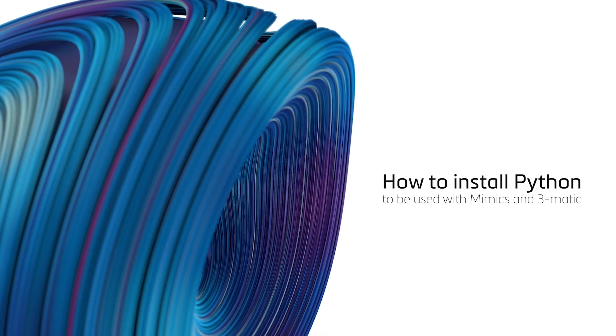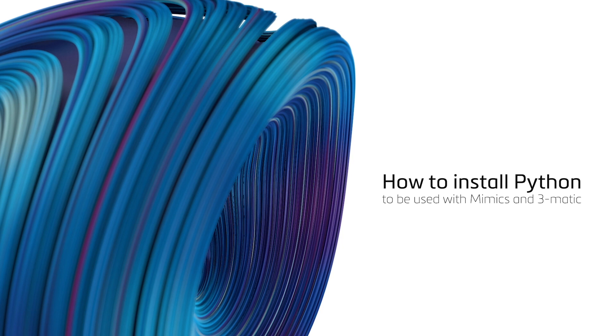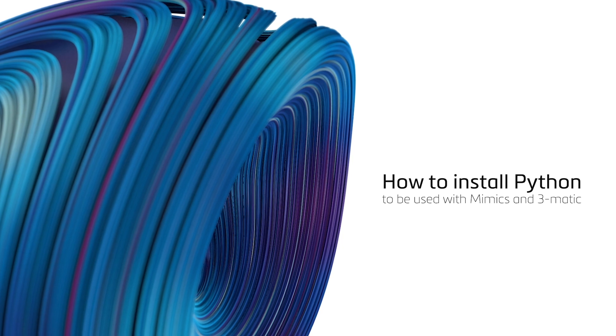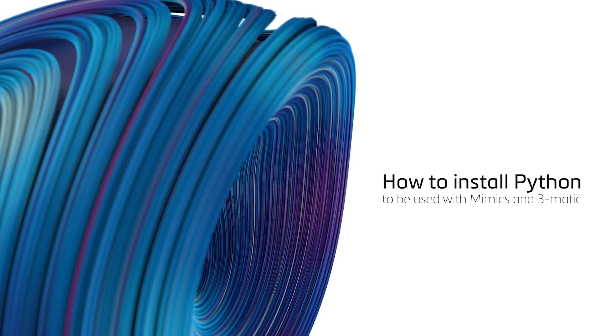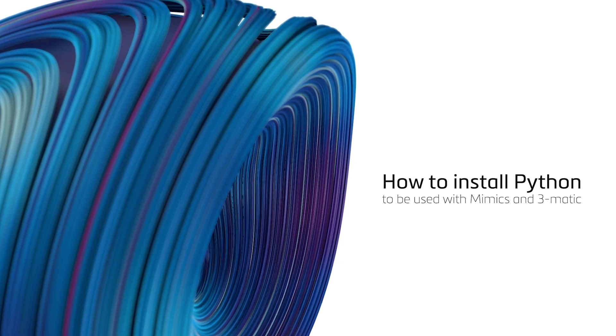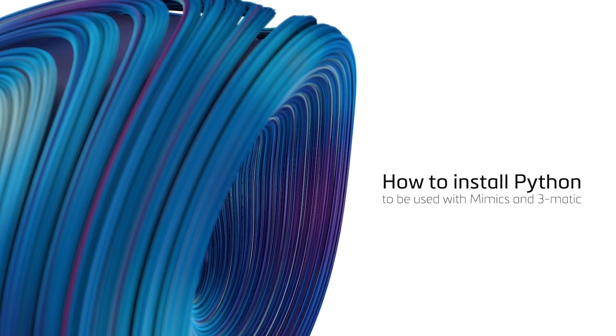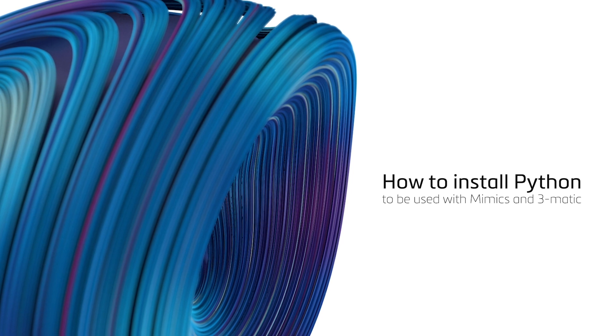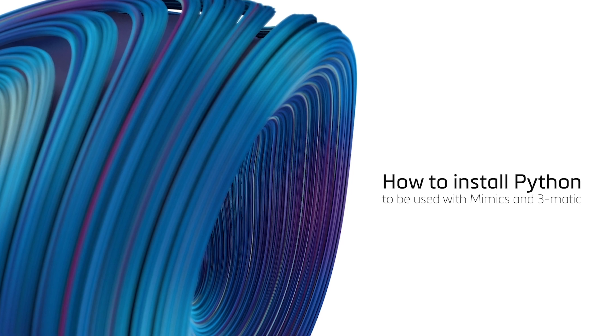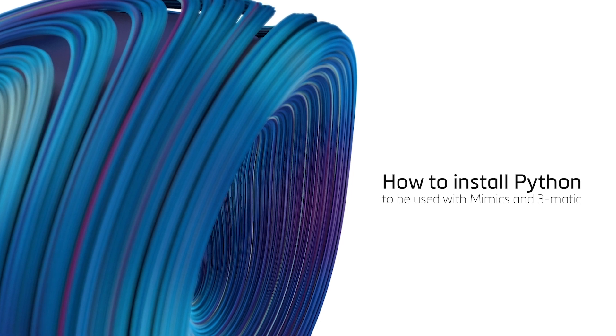Hi, this is Bhakti from Materialize Malaysia. In this tutorial video, I'll be demonstrating how to set up Python scripting for the Materialize Mimics Innovation Suite.